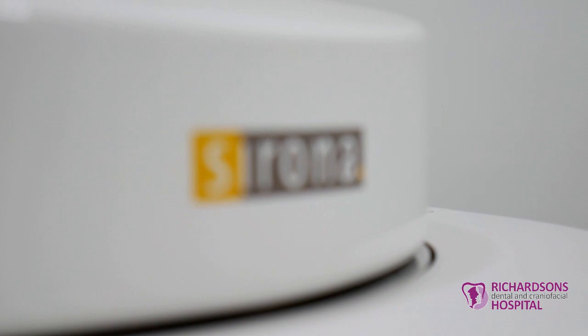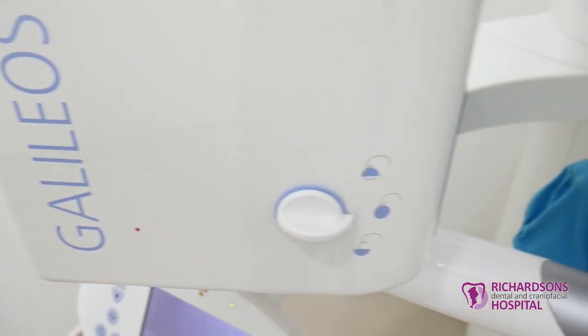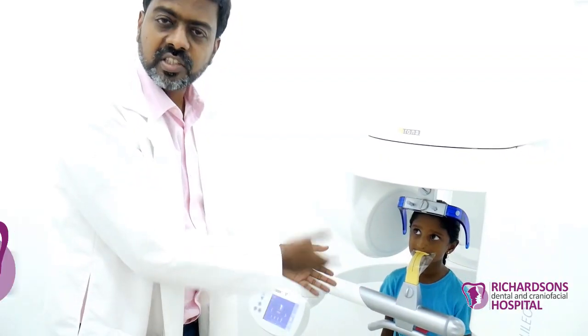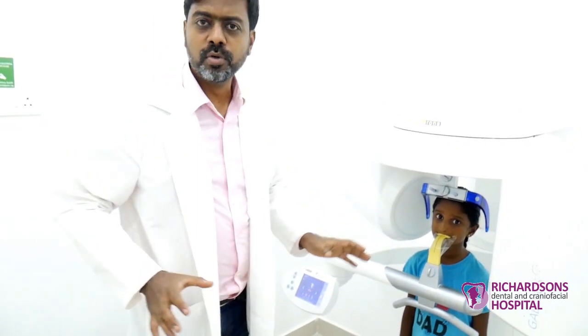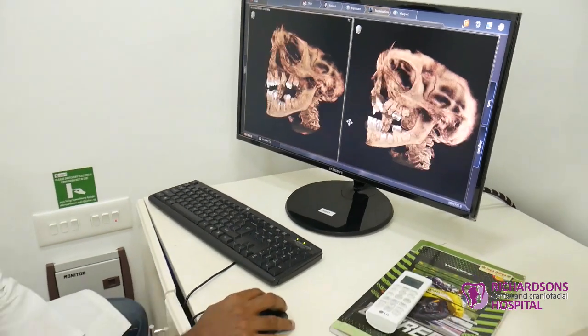This is our cone beam CT scan. Cone beam CT scan is very useful for a setup like ours because we have small kids — they don't have to lie down, they won't be scared, and the pictures are beautiful. We get really good quality, and the best part is the radiation is very low.